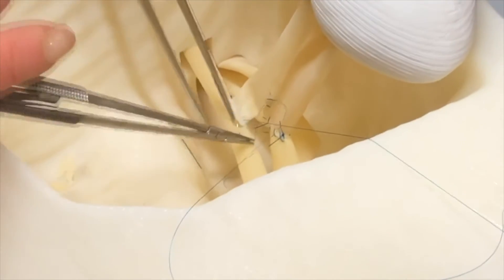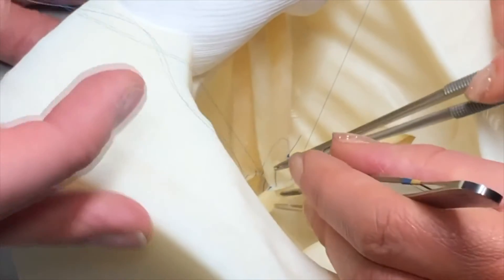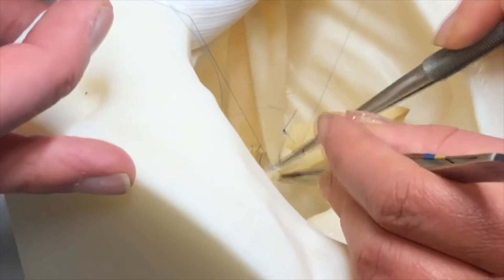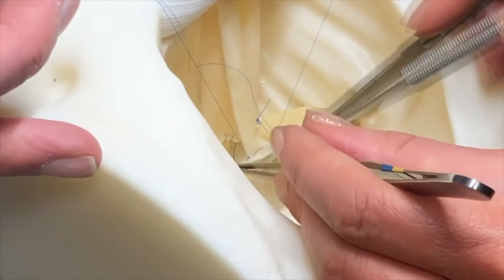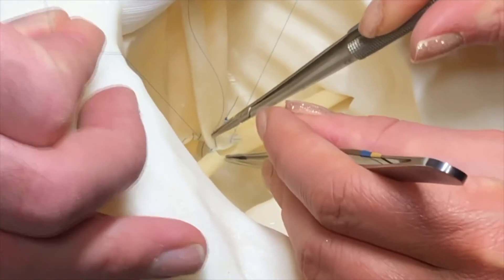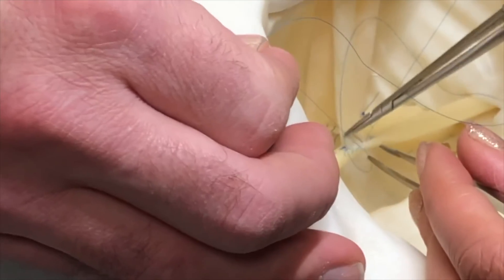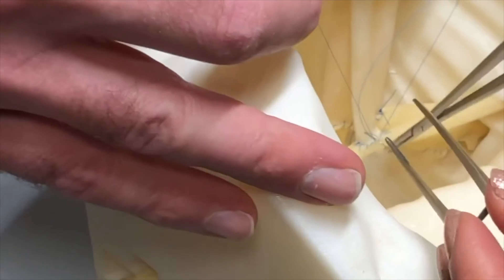I take a few additional bites beyond the corner and then switch needles to come from the top again. It is important when taking the bites on the front wall to be aware of and look out for the back wall with each stitch. Once you reach your other stitch, complete the anastomosis by tying down, but not overly cinching your knot.